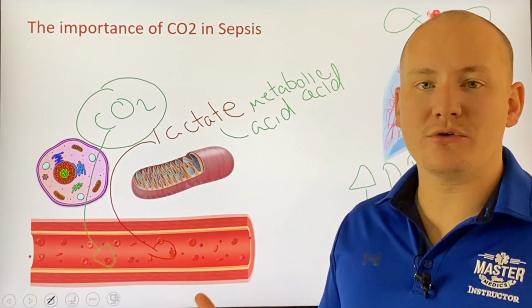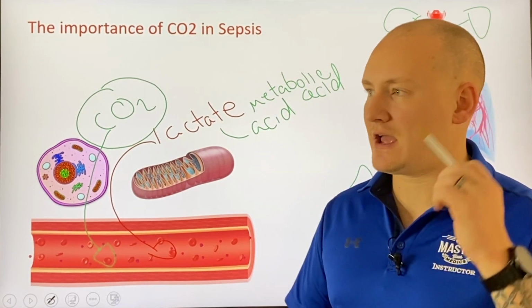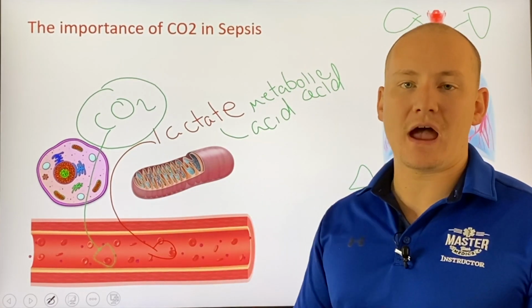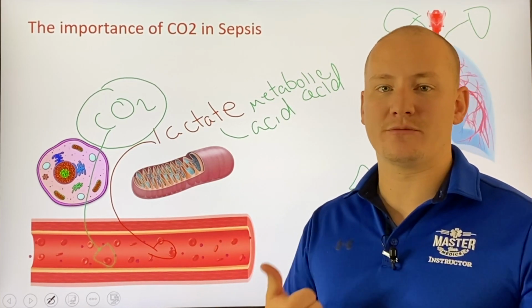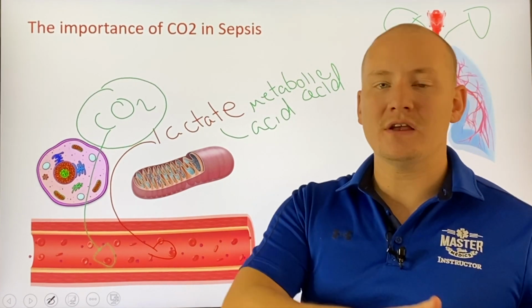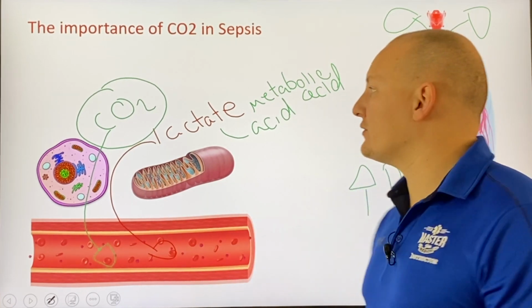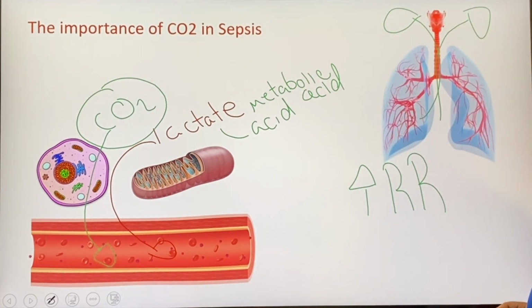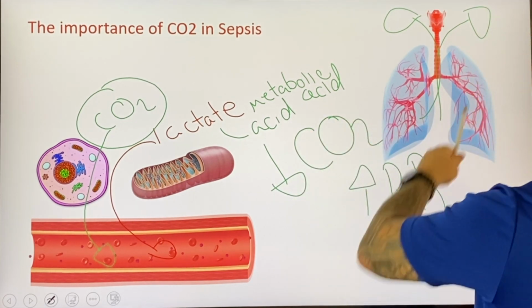And so when we come to a patient that has a fever, they're not feeling well, they have a productive cough, whatever the case may be, they have sick symptoms. They have sepsis-like symptoms. They have 2 or more symptoms on the SIRS protocol. Whatever the case may be, another good indicator with that assessment is using end-tidal CO2 to confirm our findings. So we'll put an end-tidal CO2 monitor on these patients, and what we'll typically find is a decreased CO2 being recognized.